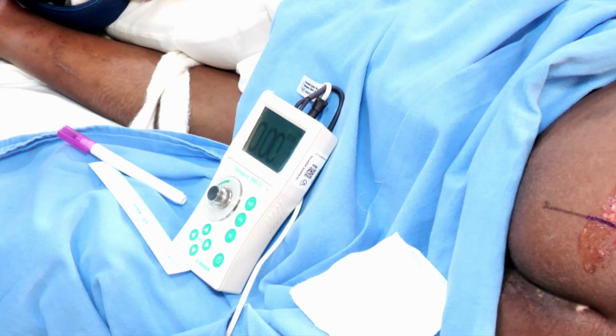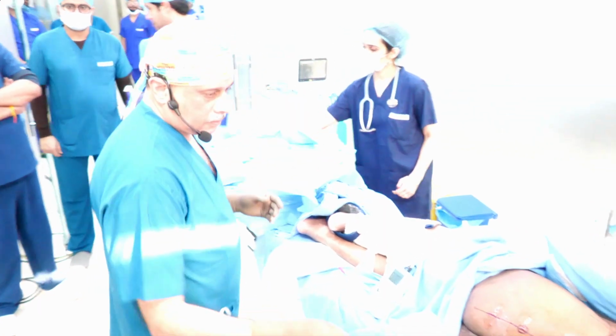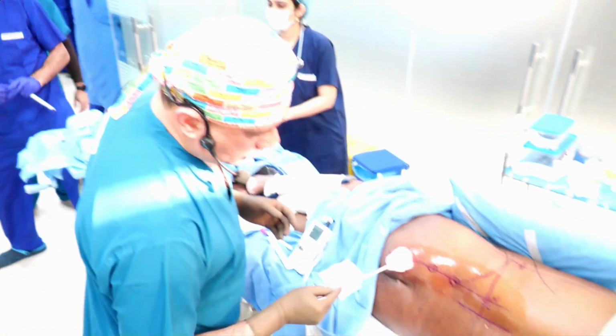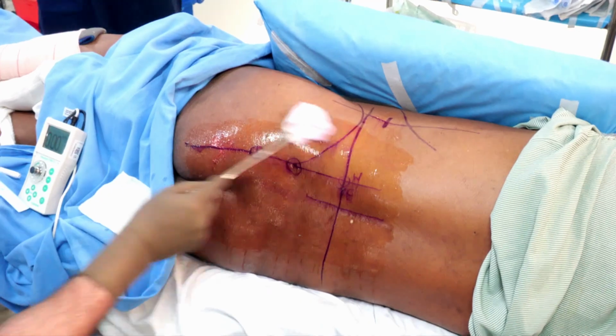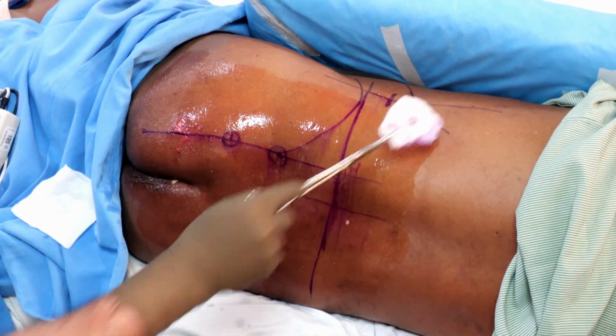So any questions up till now? The neurostimulation as well as the ultrasound technique, is it clear? We are going to use dual guidance so as to increase success. Yes, for lumbar plexus and sacral plexus, always use dual guidance.